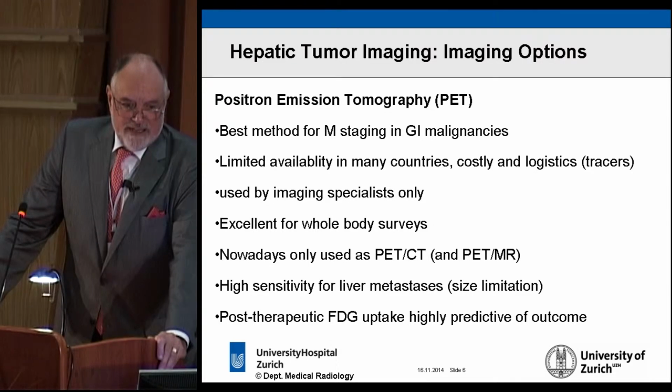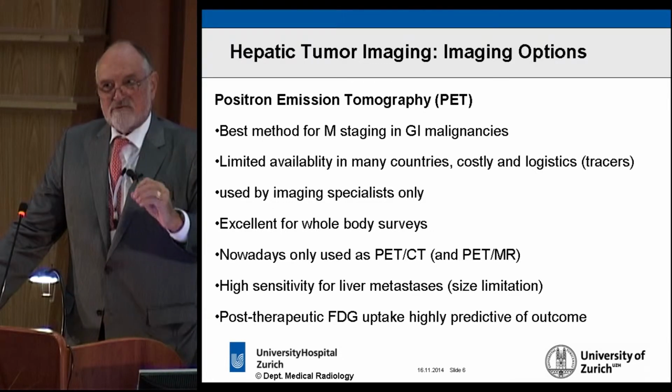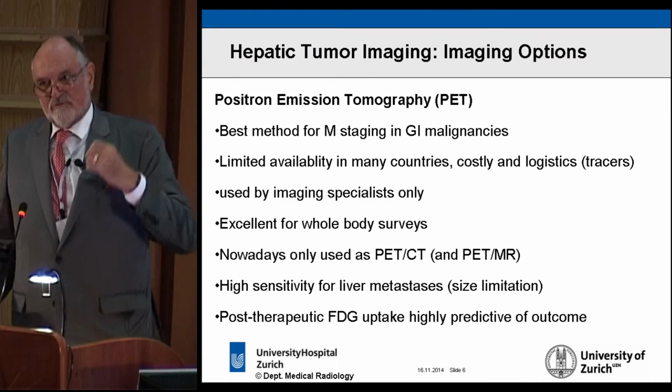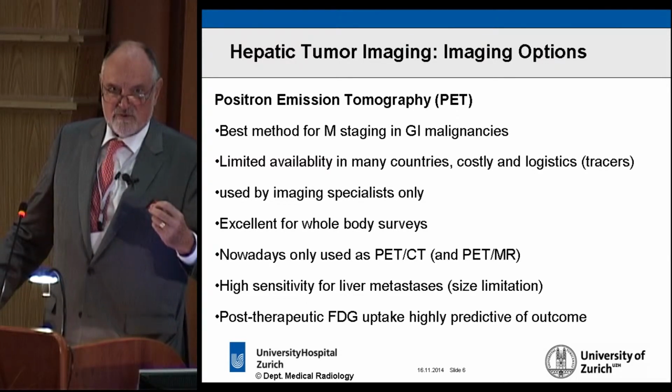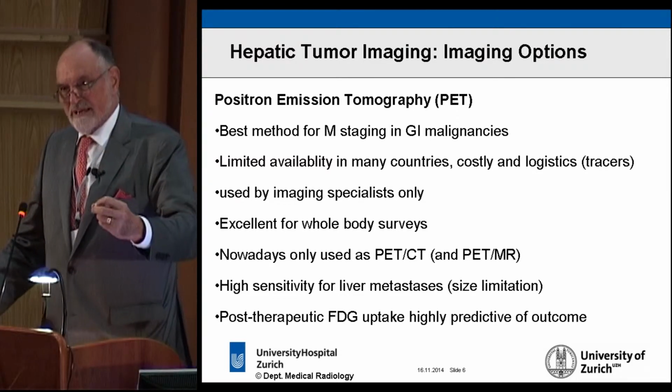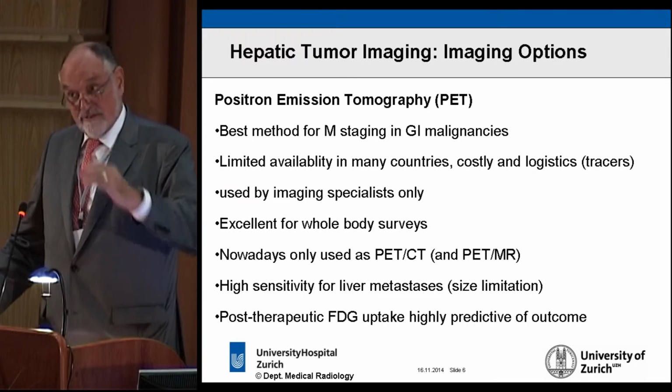Post-therapeutic FDG uptake is highly predictive of outcome. So this is very interesting. FDG is really a very good predictor of malignancy. I frequently say if you have FDG uptake in a lesion, that's bad news. If you have FDG uptake in the lesion after therapy, that's really very bad news.